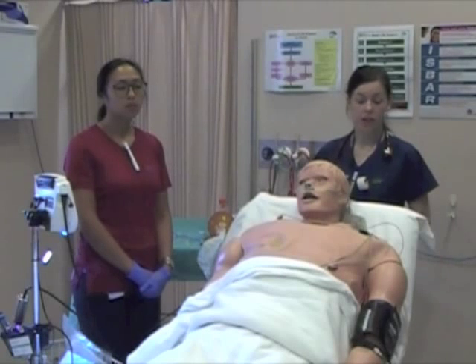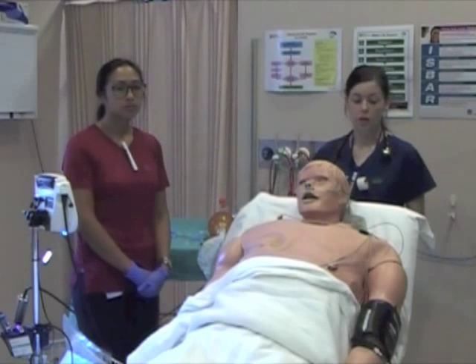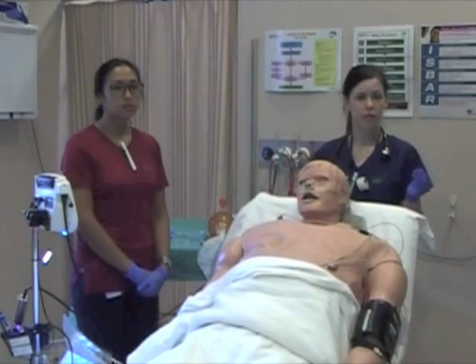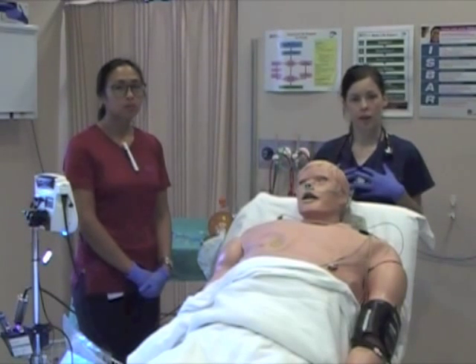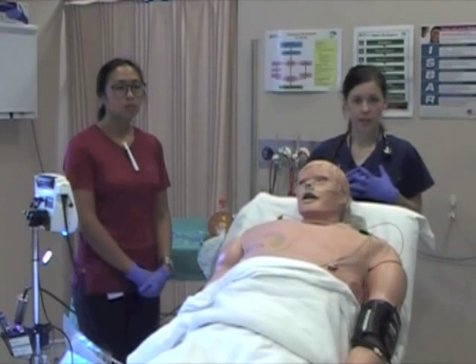Also, because he's a severe asthmatic, we're going to need to assume his blood pressure might be dropping, so we're going to have some fluid ready, some aramine, and we're also going to be ready to decompress his chest after we establish the airway. And by that I mean physically compressing his chest.